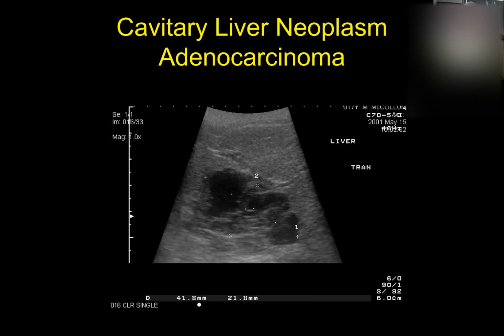Okay. But you may not get neoplastic cells, even if this is a neoplasm. So the best place to situate your needle would be one of these hypoechoic areas that have some meat to them. They have a little bit of lacy meat to them, and it's probably liver tissue that's being destroyed by this thing. And so that's the areas where you're probably going to get your highest diagnostic yield, not in a pure black area.